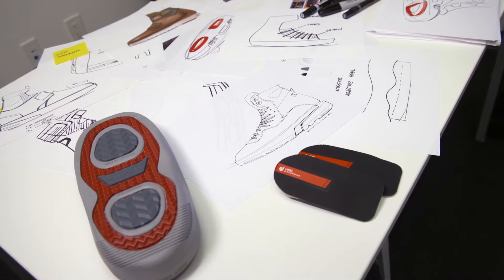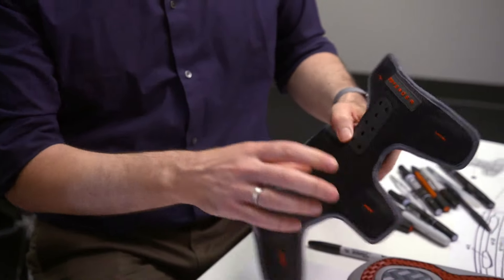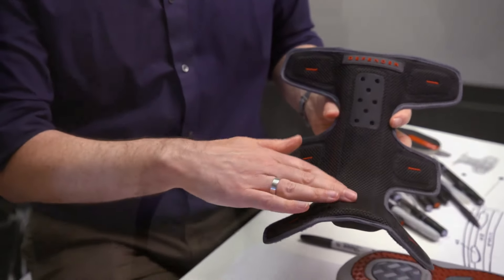We made the whole front of the product removable, so you could put it on and take it off really easily — which is another key thing. Or just set it up so you can slip into it and out of it like a cowboy boot.